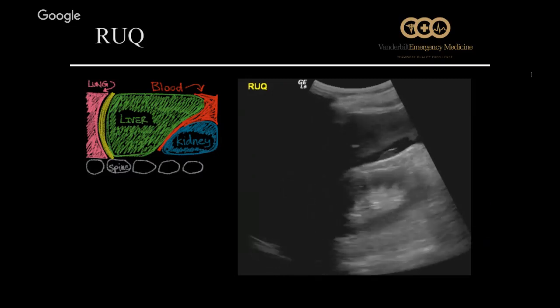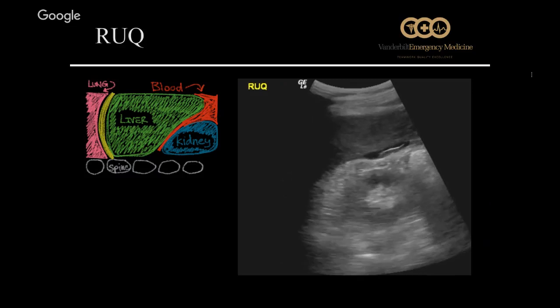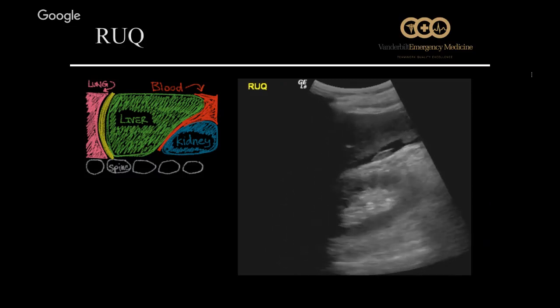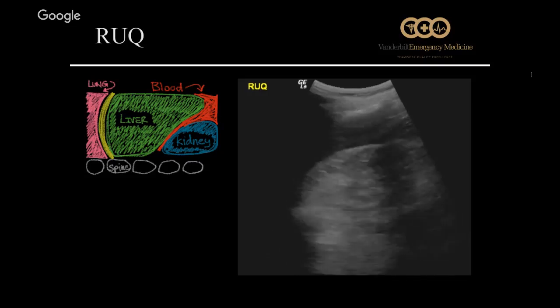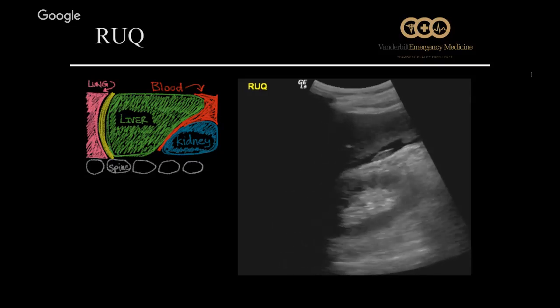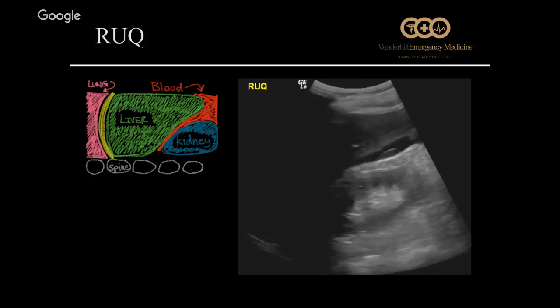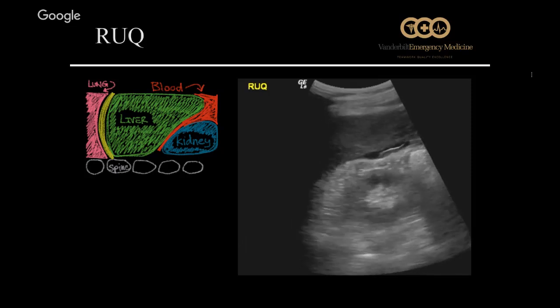Again, more free fluid. This time, a slight variation. There is some clotting in the blood, which isn't uncommon to see. So that free fluid is starting to clot a little bit, and we see that hyperechoic, which is kind of a brighter echo texture than just the black, straight black fluid. Next slide.